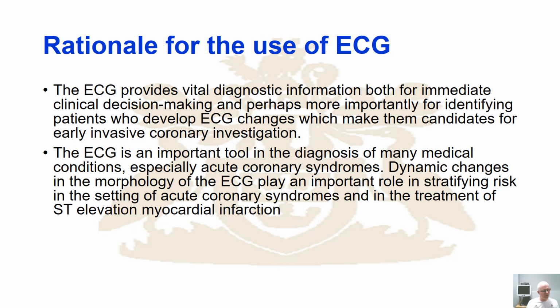In other words, you can stratify risk. And you can stratify risk in terms of acute coronary syndromes. And so you can start to deal with things like what's called ST elevation myocardial infarction, heart attack. ST elevation, ST are two of the sections on the ECG trace that we're going to look at. Elevation is what it says, so it's an elevated ST response, so there's a change in the electrical activity in that component. Myocardial is the heart, infarction is what it's referring to, the attack.